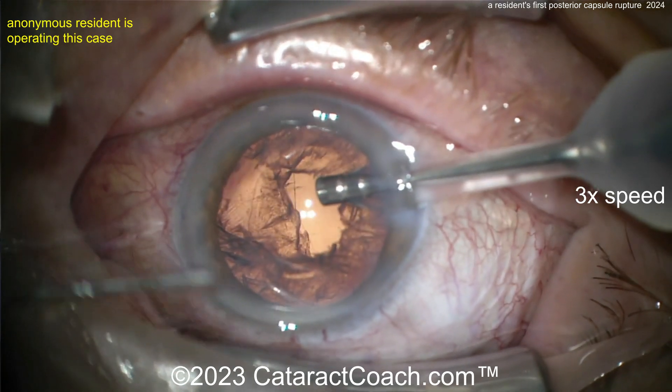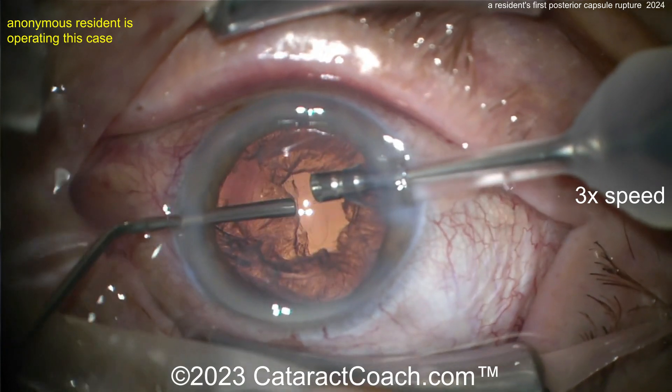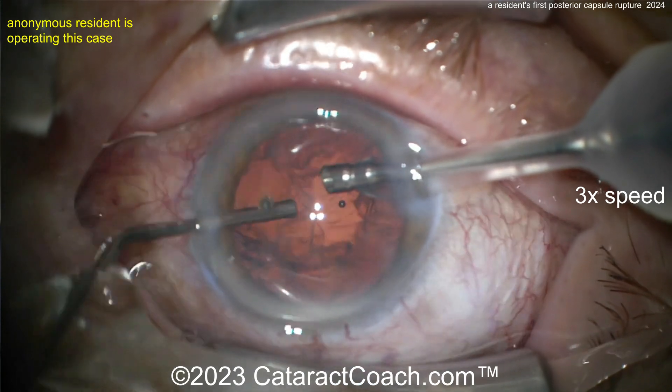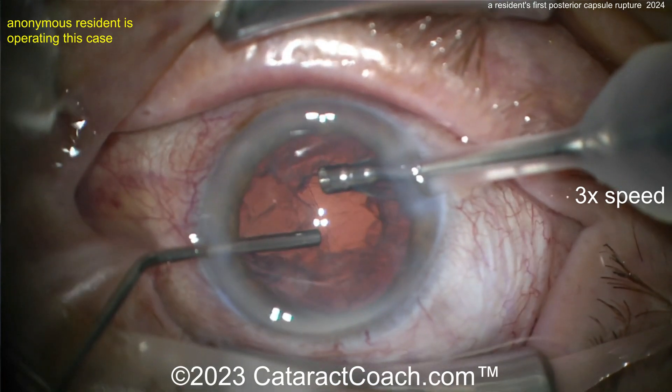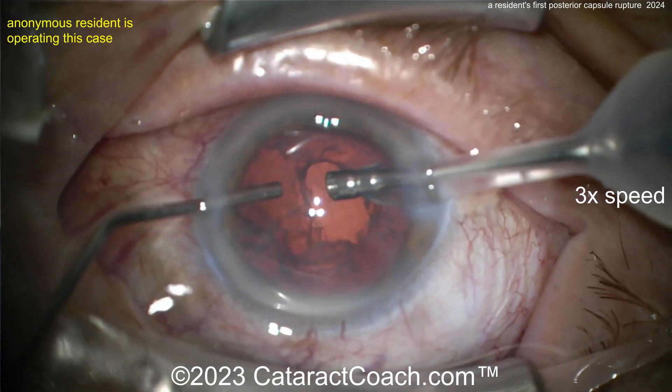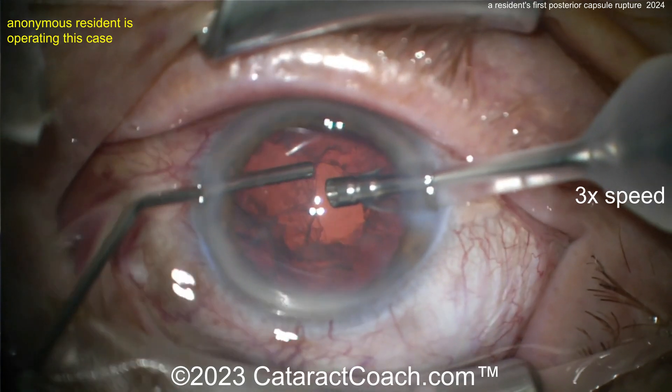Keeping the probe in the eye is a good idea because you want it pressurized. As you inject viscoelastic, take your foot off the phaco pedal — go to position zero. You don't want to wash out all the viscoelastic. Then come out with the probe.